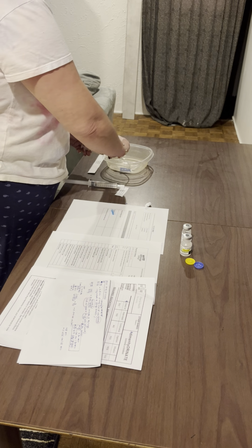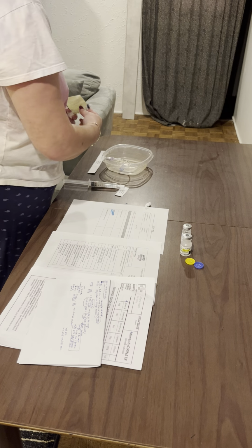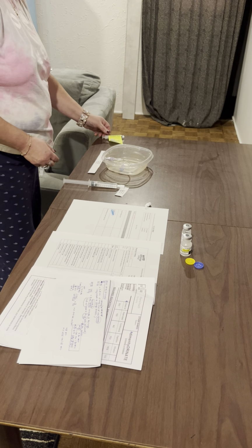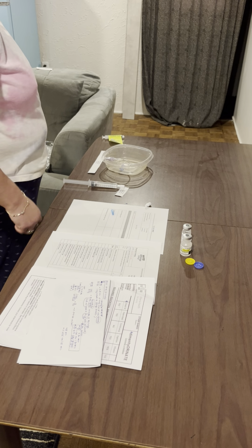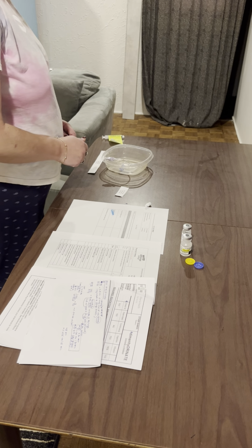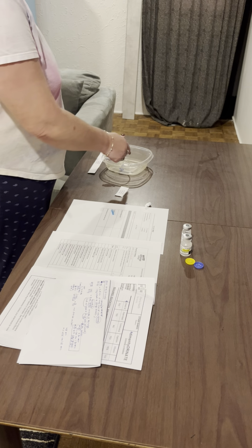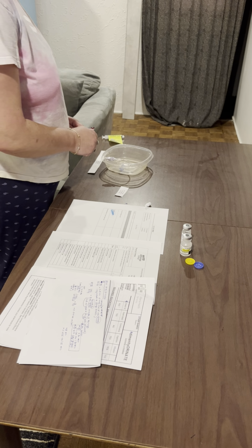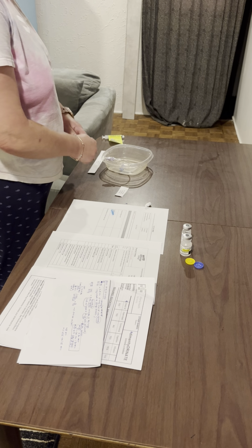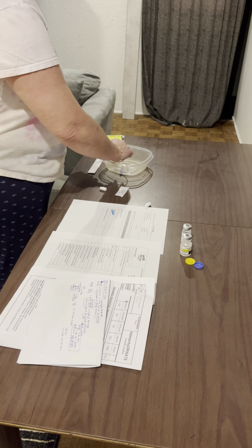So now we can just disconnect the medication, and we can get rid of it. The medication can go in the sharps container even though it doesn't have a needle. And now what we are going to do is flush to ensure that all the medication goes into the site through the line. So we will take the cap off the second flush. Again, maintaining sterility, we'll twist and push.